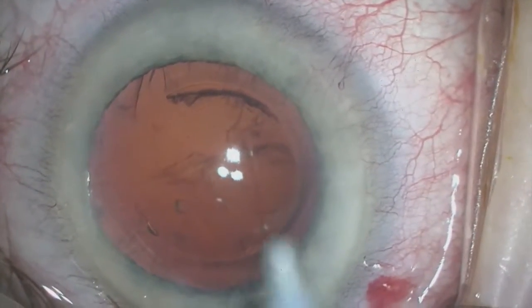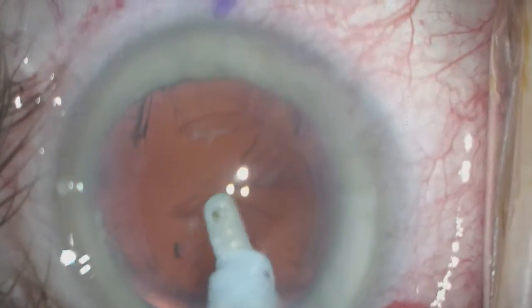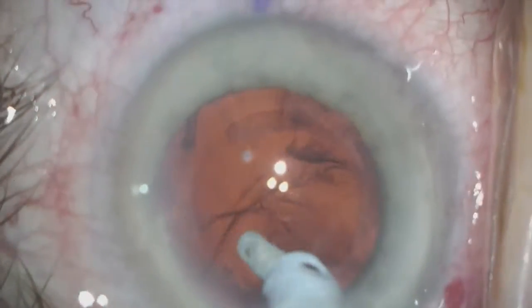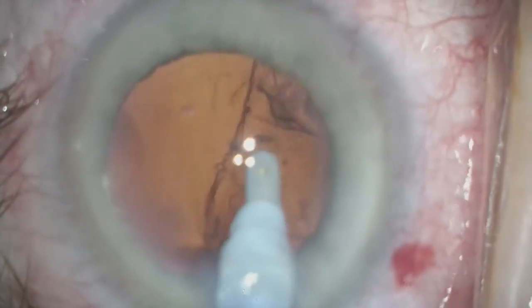At this point, we feel it is safe as the capsule is intact, so we go in and remove all residual cortex from the capsule. Usually I start in an approximately subincisional area, remove as much subincisional cortex as I can, and proceed clockwise around. This cortex comes off fairly easily and without event.